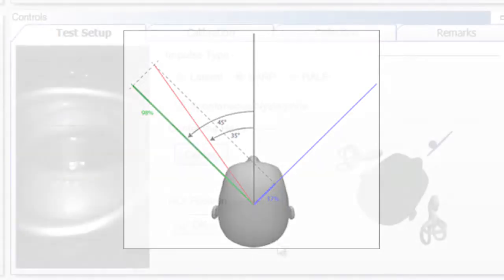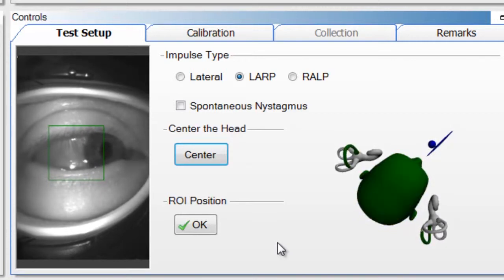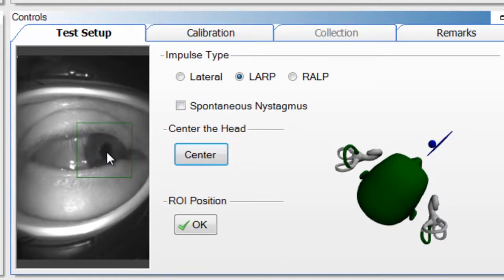For LARP — left anterior, right posterior — move the head 35 to 45 degrees. You can see the head indicator is green, the left anterior canal is green, and the right posterior canal is green. Once the head is positioned properly, slide the ROI box over and make sure the pupil is centered in it, and verify the patient can still see the fixation dot. You do not need to recalibrate; the calibration done at the start of lateral is saved and will be reused for LARP and RALP.